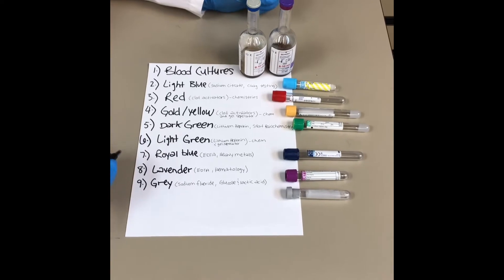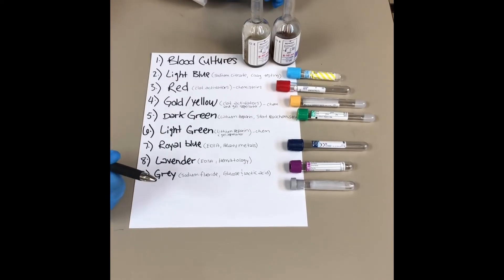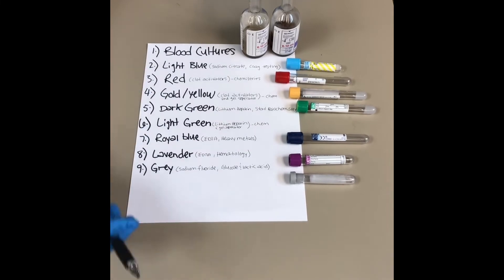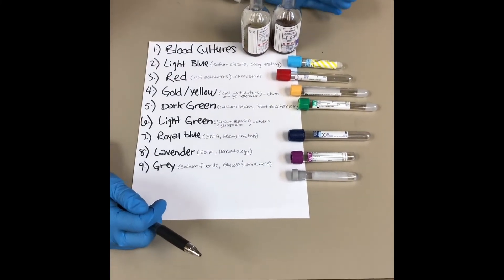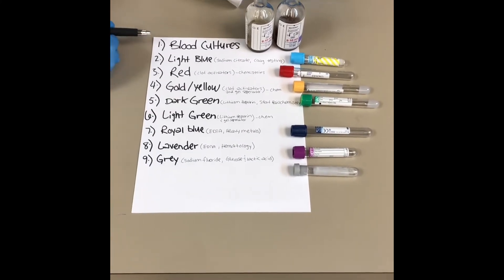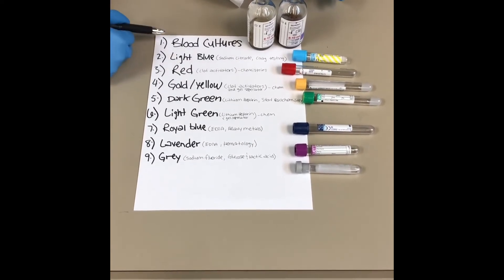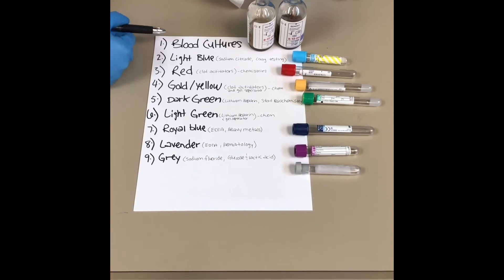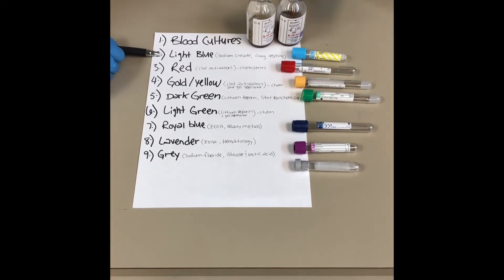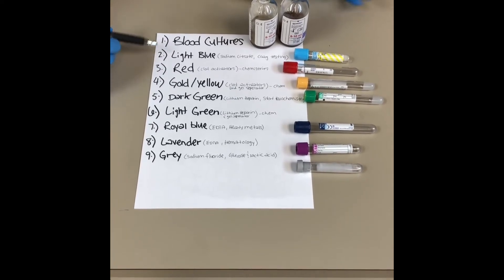Another topic that's really important with phlebotomy is the order of draw. We have specific guidelines and tube orders so that things can be drawn correctly and they don't cross-contaminate or get EDTA or other additives into tubes that aren't supposed to have them, so that testing runs smoothly and we don't have to redraw. We always start with blood cultures because it decreases the chance of contamination, so you can tell if something is actually pathogenic as opposed to just normal flora. Then we start with the light blue, which is first of the small tubes because it has to have that one-to-nine ratio with sodium citrate — this is the tube we use for all of our coag testing.